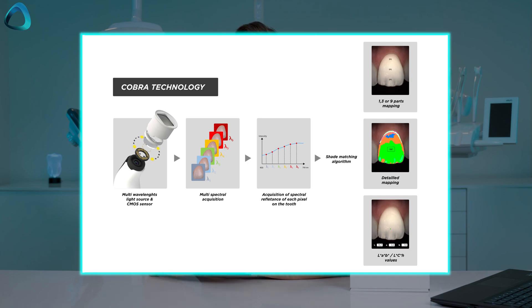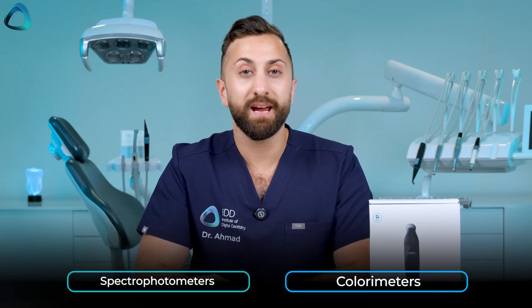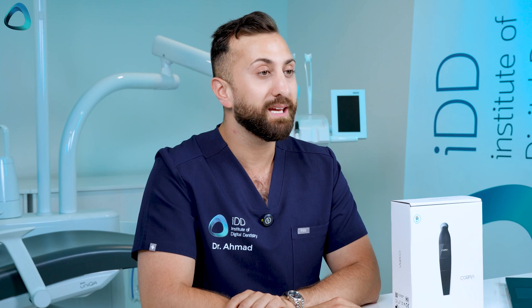A spectrophotometer is a device that measures the exact tooth color by analyzing how light reflects off the tooth surface at different wavelengths. There are two types of shade detection devices: spectrophotometers and colorimeters. Unlike the simpler colorimeters that just measure basic RGB colors, spectrophotometers break down light into its component wavelengths, giving a much more detailed and accurate shade detection, eliminating guesswork and providing consistent, reliable results.